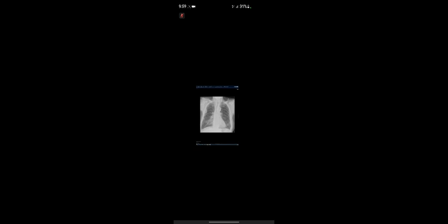So on the X-ray, one patient ago, what was the mistake you made? I immediately didn't recognize that the mass could have another differential, that it had obtuse margins. You didn't pick the bone destruction. Yeah, I didn't pick. Is there bone destruction here? Where is this rib? Oh, yes. Okay, that one would have been a bit advanced.